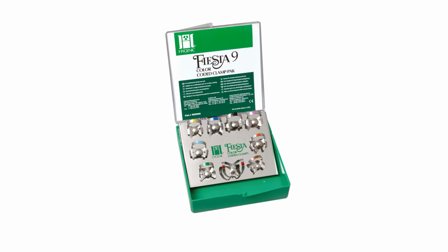The other thing is to get the right clamps. There are two types of clamps that I like to use. You can see here the Fiesta color-coded clamps. They're a great little set. They've got pretty much everything you're ever going to need in terms of a rubber dam clamp.